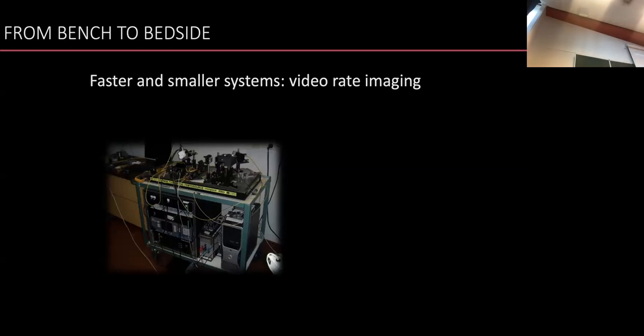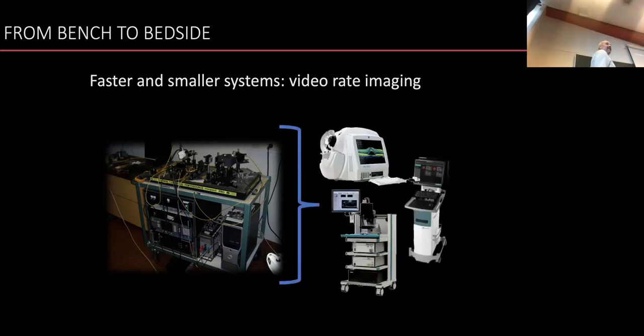We reduced the size from the optical table to a little cart, still with all the optical components there, the laser, everything. And we were allowed to bring this into the clinic and do measurements there. You can hardly believe it anymore right now with all the regulations out there. But back in the days, this is what we did. It helped us. I think we used it in ophthalmology, but also a little bit in some onco-related research questions we had back then. But the setup itself really scared the patient so much that it was always the question if they would come back to the hospital.